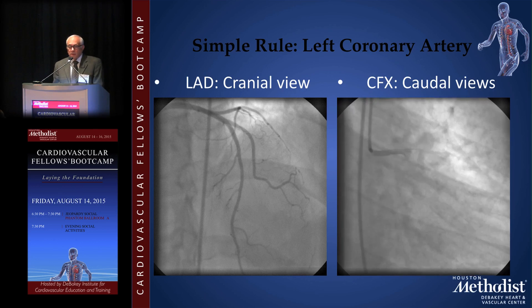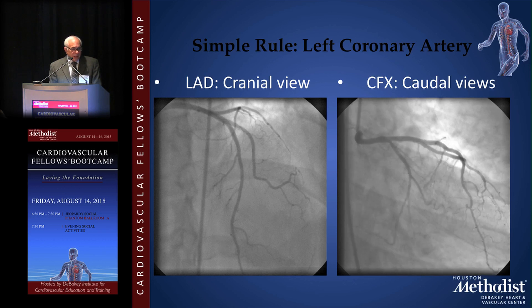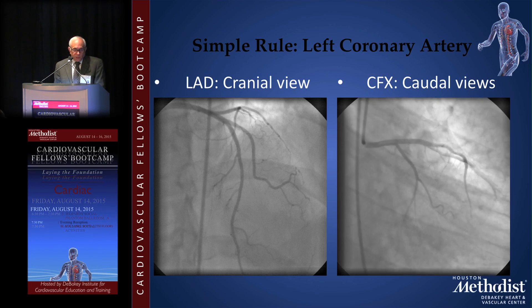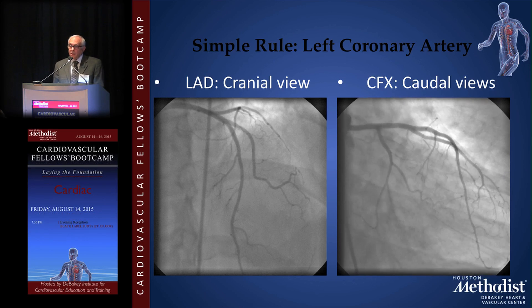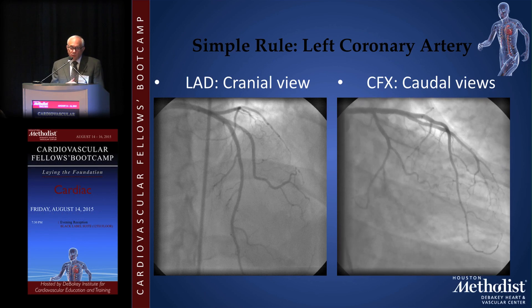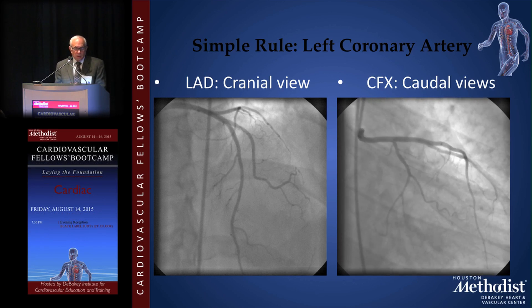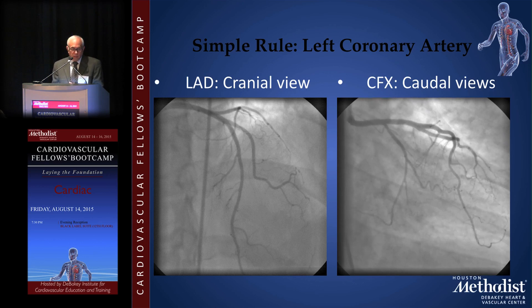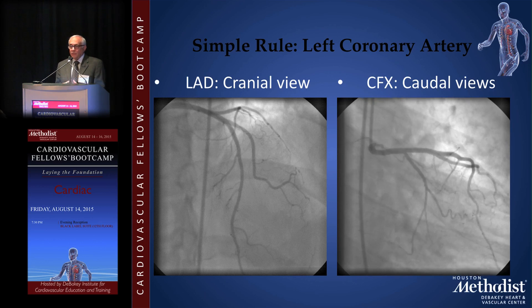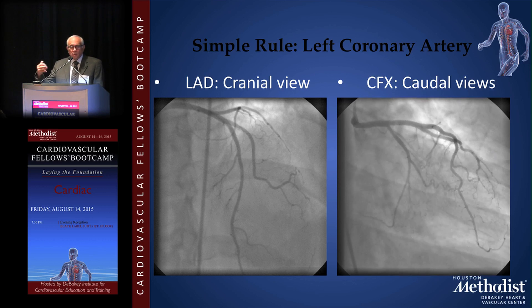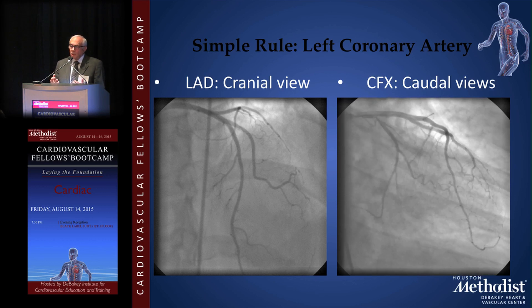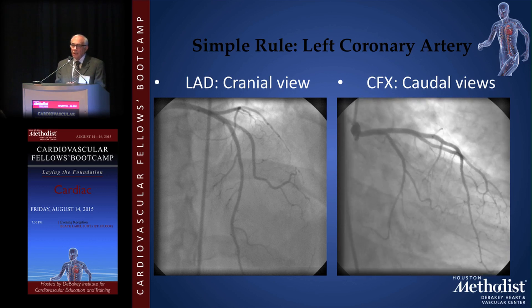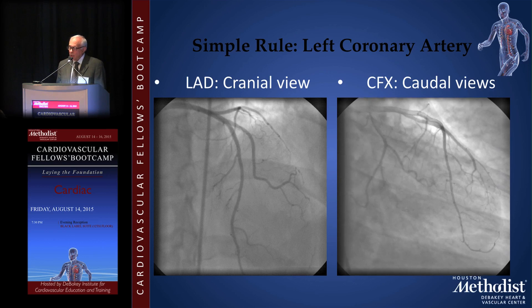The right coronary artery is a little simpler. The body of the right coronary artery is best seen in an LAO view. The branches are best seen in views that profile the right coronary artery, such as the RAO view. We also use the LAO cranial view, which shows not only the body but also the branches quite well.